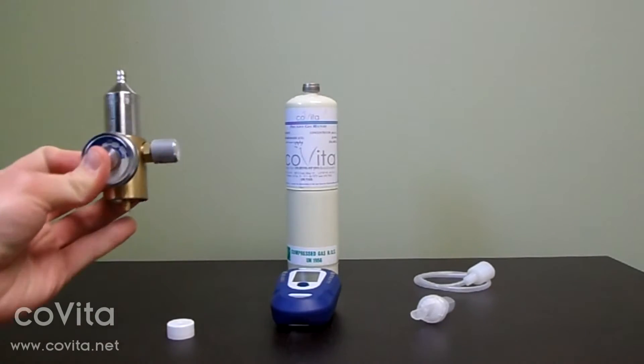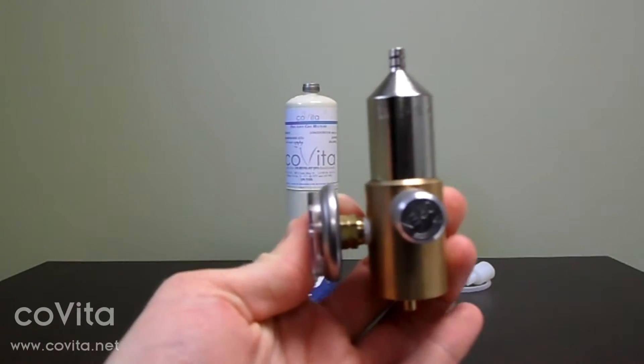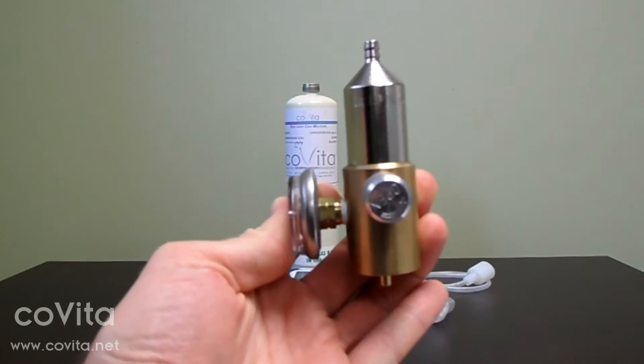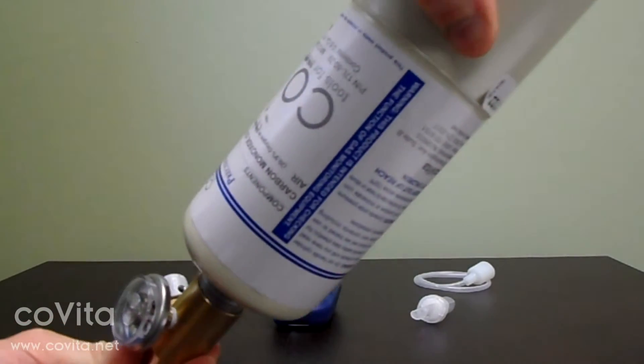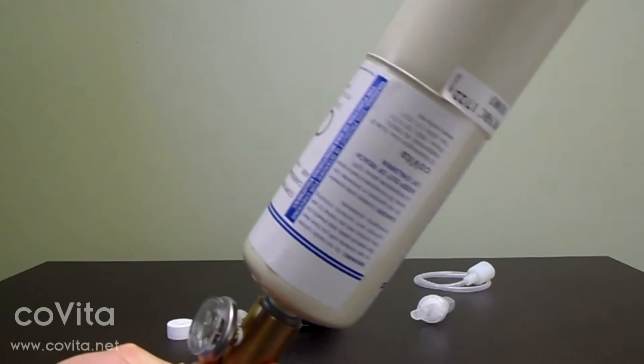Next, ensure the regulator valve is closed and then connect the can to the regulator. This is easiest to do by holding the can in the palm of your hand and the regulator in your left hand. Apply pressure by screwing the can into the regulator.